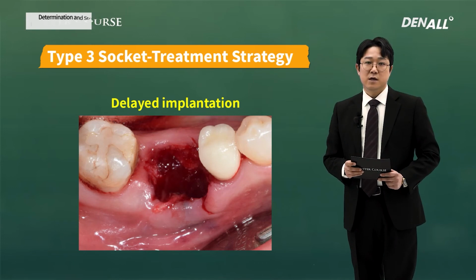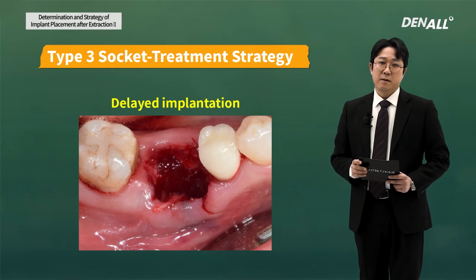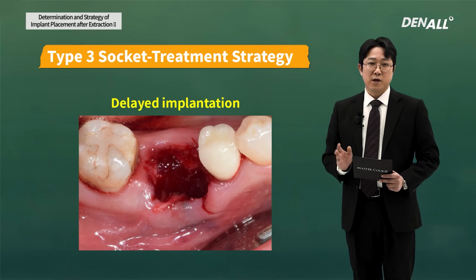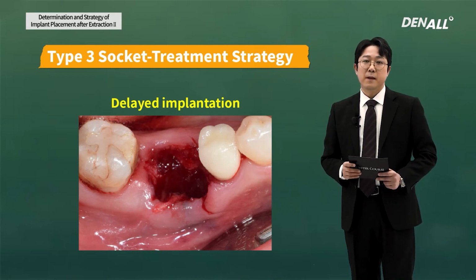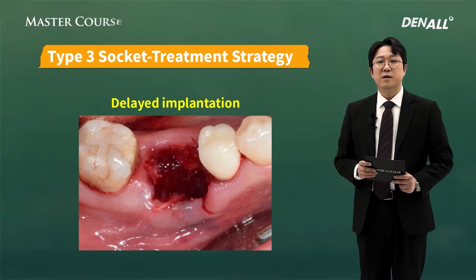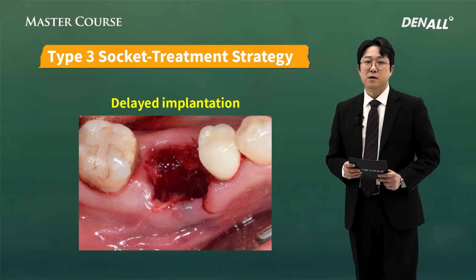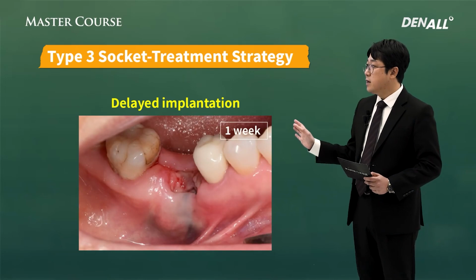In order to do implant treatment for this patient, I explained that bone graft was necessary and the patient felt stressed and could not make a decision. We did extraction and waited, deciding to take our time in making a decision.